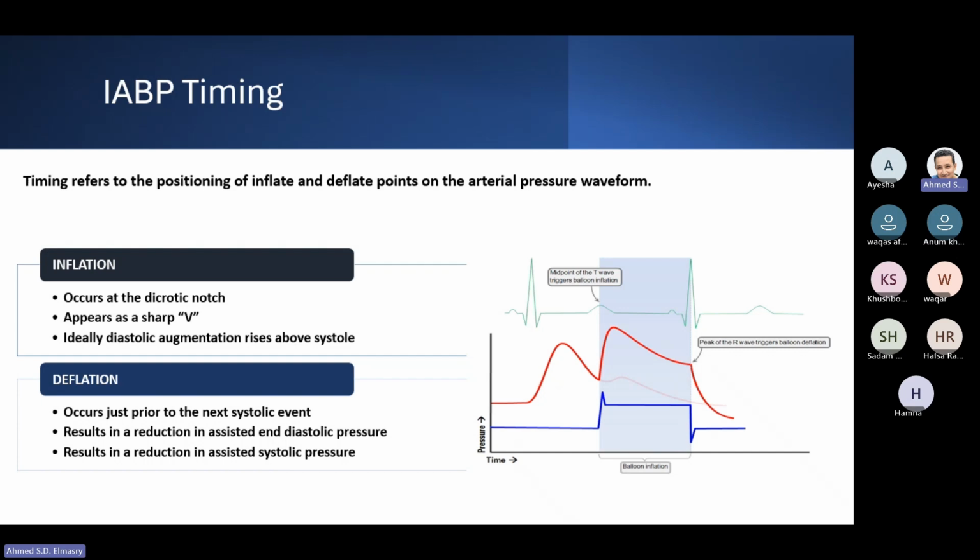Okay, got it? Yeah, I got it according to the waveform. But you know what? It will happen. I want to know about this situation, vasoplegia itself. What will the situation be like for the body?